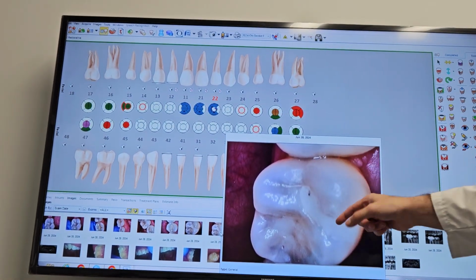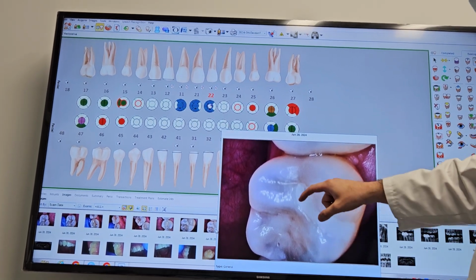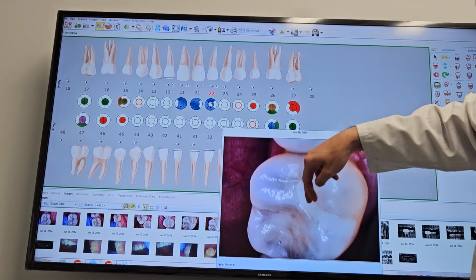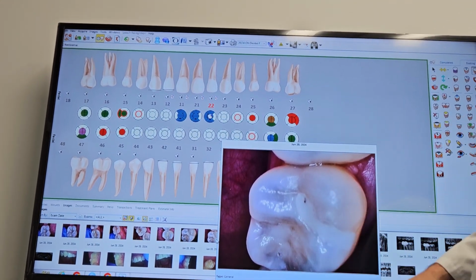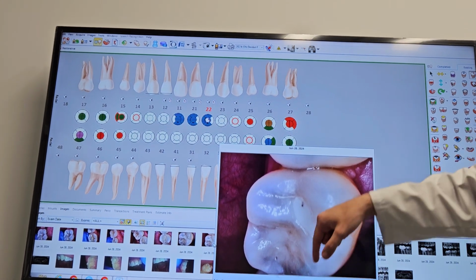It looks tiny because the bacteria can't eat your old filling, but it's eating the tooth underneath. So this whole thing is probably going to need replacement. And same with here. Here it's actually very large. A lot got under here, this little hole. Look how white it is. Look how dark this whole area is. There's a lot of decay under there.